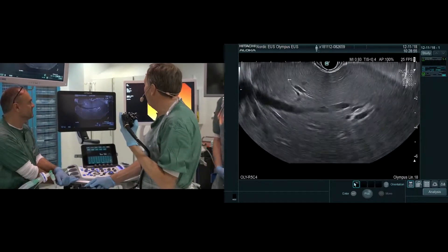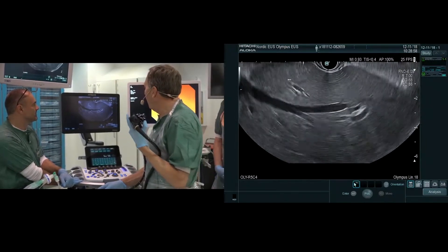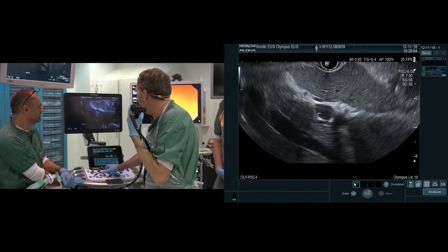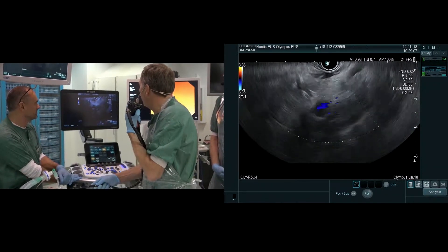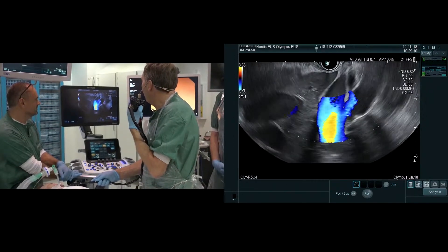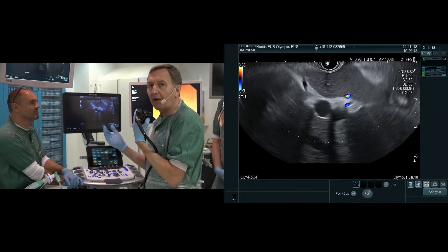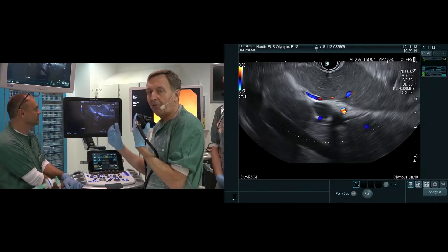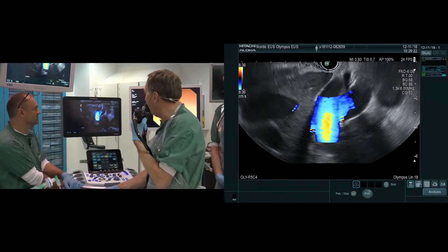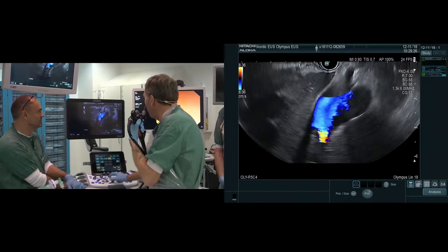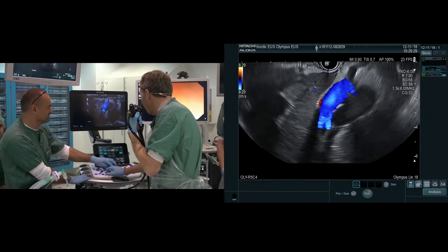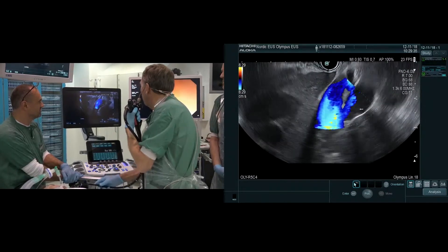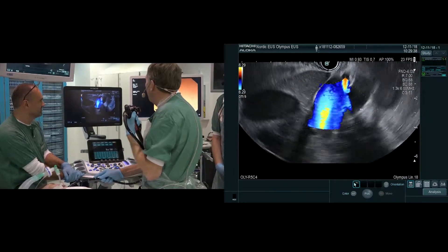You now have the possibility to rotate the instrument along the left liver lobe to the hilum. This is the portal vein. We can put the color Doppler inside. With the longitudinal scanner it's sometimes very easy to see the higher part of the common bile duct — the proximal and middle part — behind the portal vein. This one is the common bile duct, and you can see that the common bile duct is really dilated.